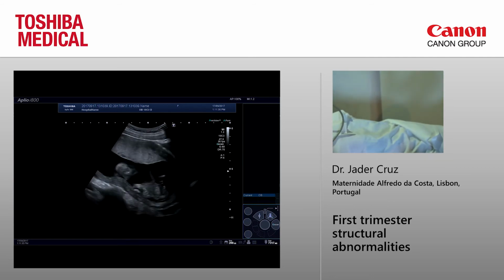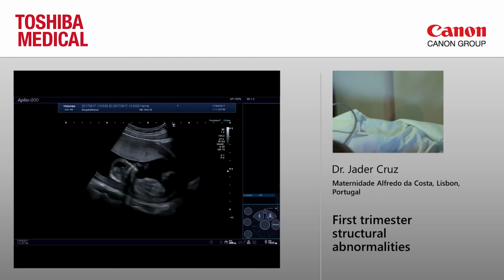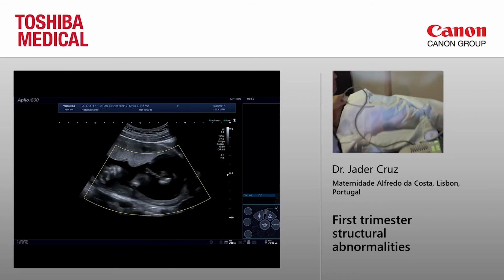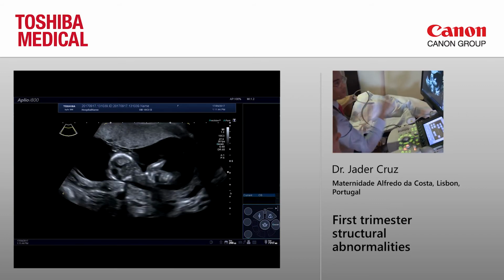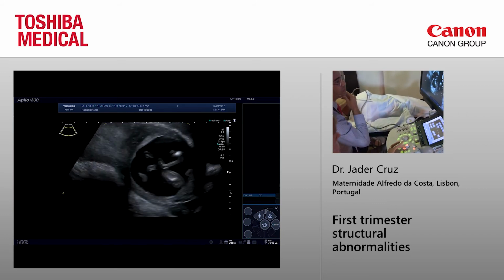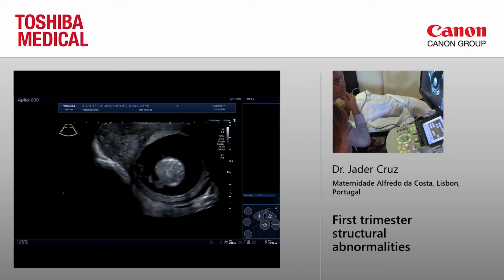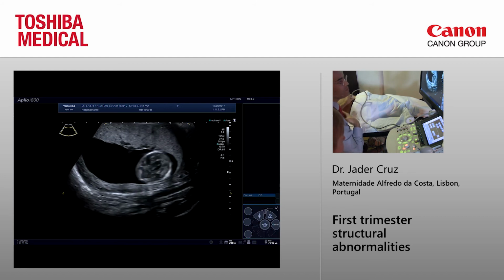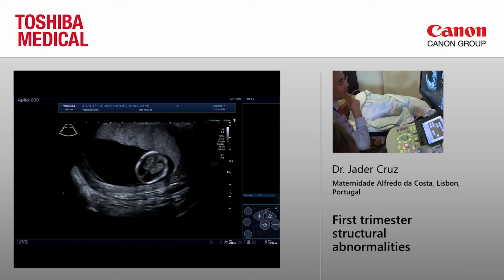Okay, baby is not, no, it's a little sitting, but not that much. So we always start, and I'm not going to say that Petra didn't load my presets. You have two sets of presets. You have my presets, and then the presets that Petra calls mine.